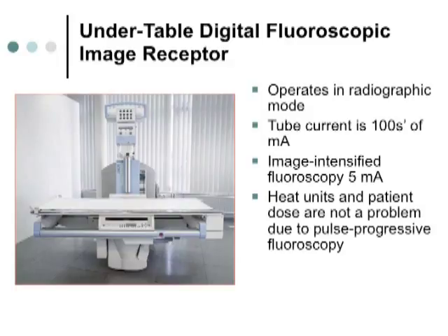Okay, the new digitals operate on what they call pulse radiography or pulse current, whereas the old ones ran on 3-phase 6 pulse. We had 3 phases of electricity and 6 pulses per 60th of a second. So a total of 360 pulses per second with the conventional old machines. The problem with those type of machines were heat units. So we had to use very low MA because the X-ray production was so high. So two problems, you could burn the patient or you can burn up your generator.